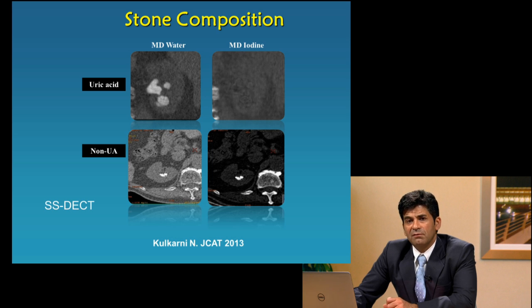Now, first, if we look at one common application where CT is routinely used in North America, it is in the adult patient with kidney stone. And this problem afflicts millions of patients, and the prevalence of this disease is rising, to the extent that from the 1960s to now the prevalence has more than tripled. And management is complex for these patients. One of the treatment decisions is based on the stone composition, or how hard or porous the stone is. Now, uric acid stones constitute about 10% of these kidney stones, and these can be managed medically.